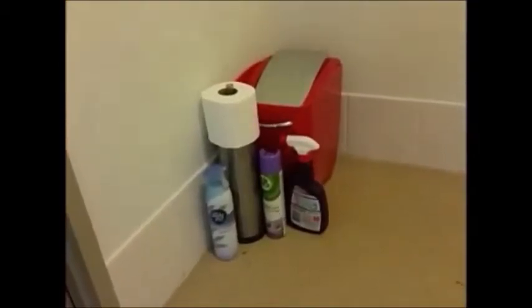Okay, we've completed our QC and we're about to commence testing, our breath testing and onsite urine testing. I've already set up the bathroom and cleared everything out. It is a NADA requirement to ensure that everything is removed that a donor may be tempted to use or hide something in to adulterate their sample. As you can see down here, everything's removed, any cleaning products, toilet paper, the bin, all removed outside.